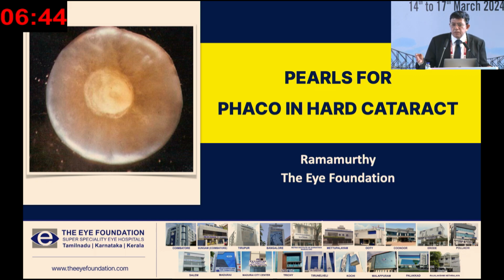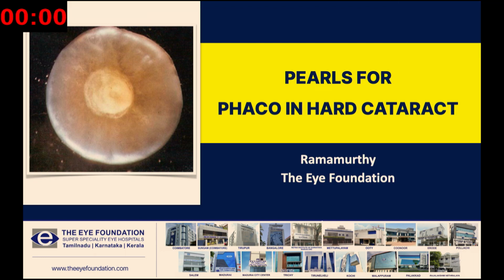As regards usage of premium lenses in a post-refractive surgery scenario, I would like the three of you to comment just briefly. Yeah, I think regarding the post-refractive, she's covered it pretty well. I have only one thing to add. If a person has had a PRK done, then you don't need to do any of these things because the cornea still has the ablation profile that has been done. So after a PRK, for cataract surgery you would want to do a typical monofocal or maybe a monofocal plus. You won't want to look at EDOFs, or multifocals.